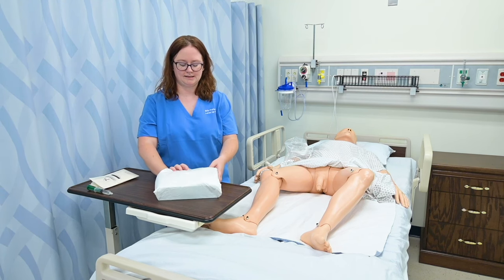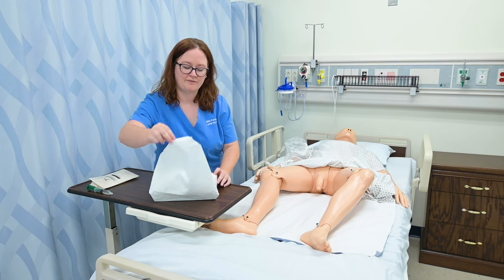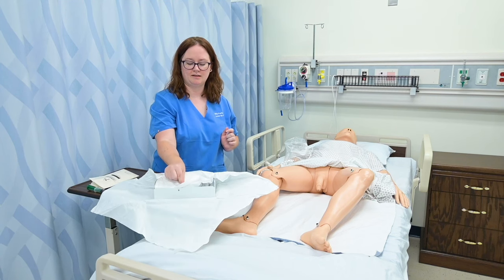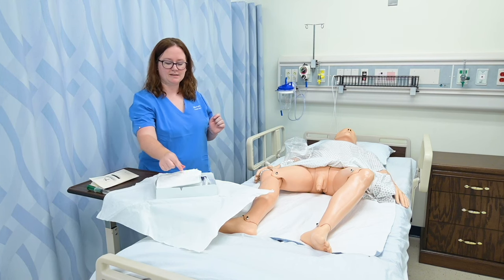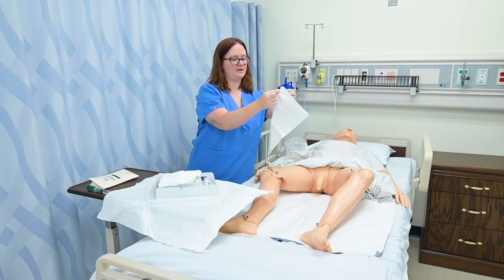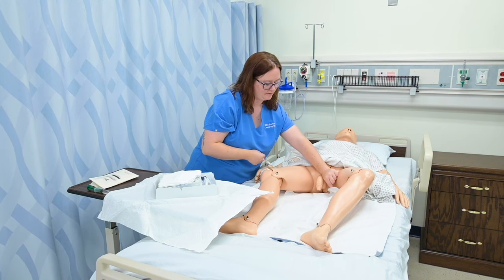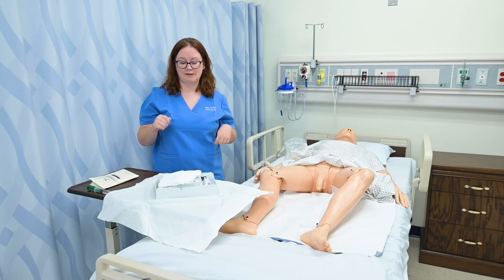I'm going to unstick this and then I like to do this at a bit of an angle — I'll do my first side, then my sides, only pinching that outside material, and then the last one towards myself. I'm going to sneak in and grab this first drape. I'm going to only touch the outside, just pinching it gently, and put it on the bed shiny side down.